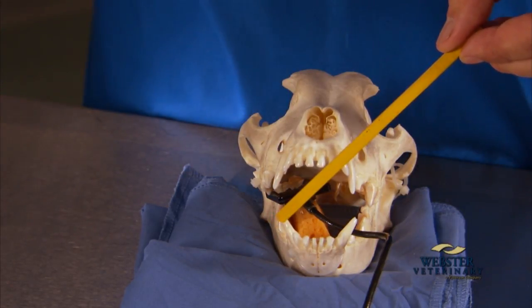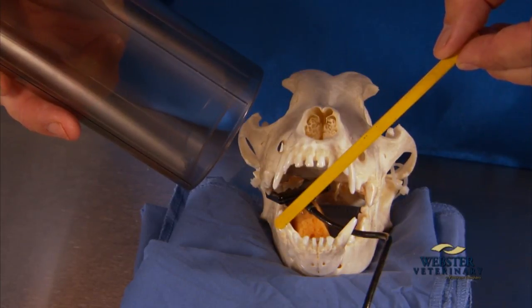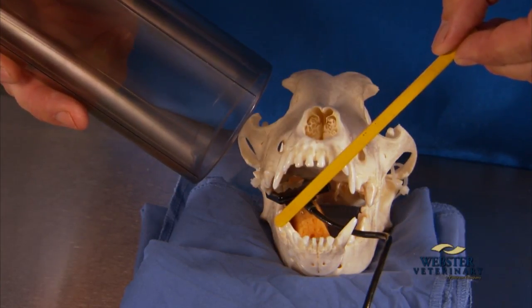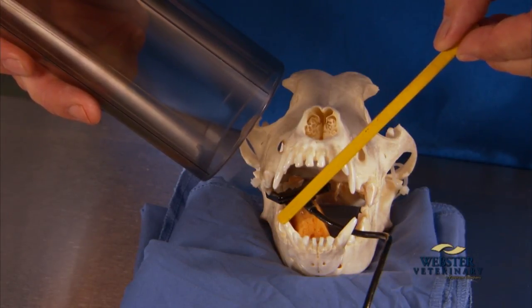The cone head is positioned into a bisecting angle centered over the fourth premolar, actually centered between the distal root of the fourth premolar and the first molar, in order to achieve a good image of the distal root of the fourth premolar and the neighboring teeth.